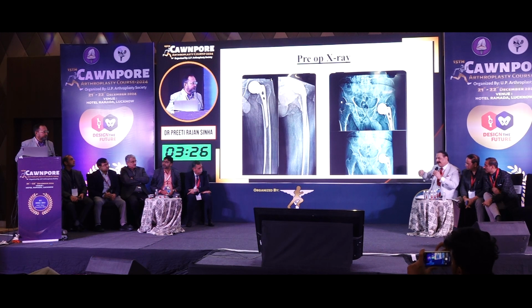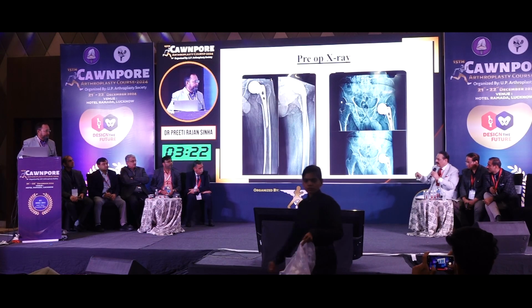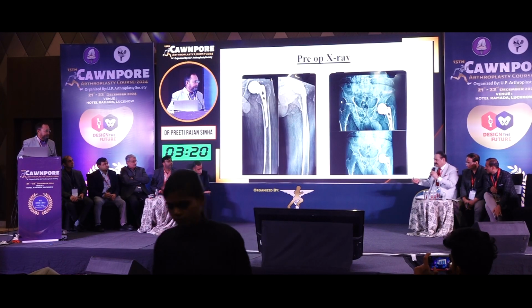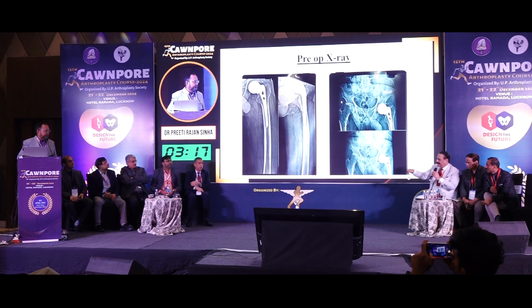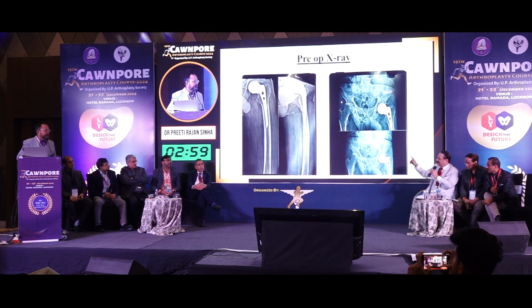Number one, starting from the very beginning, be careful when you dissect and dislocate. Don't try to rotate; you might create a fracture. Keep a bone hook handy, do a full capsulectomy, and then with the bone hook you take it out. Second, once you bang it out, because the metaphyseal area might be weak, you think of a distal fixing stem. If you find it is a good metaphyseal area, you can think of any stem, or any cemented stem. If metaphyseal bone is poor, you need a distal fixing stem or a cemented stem.